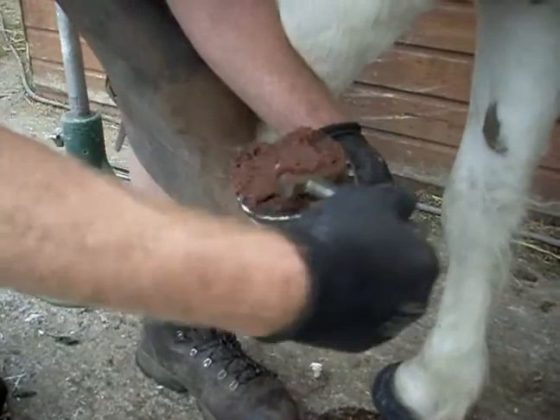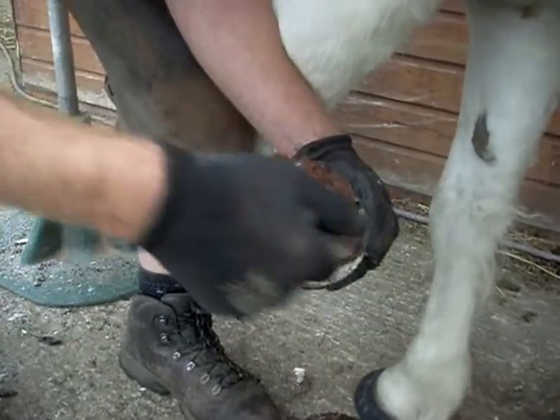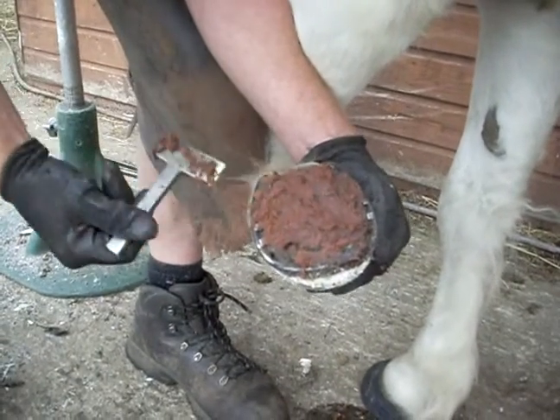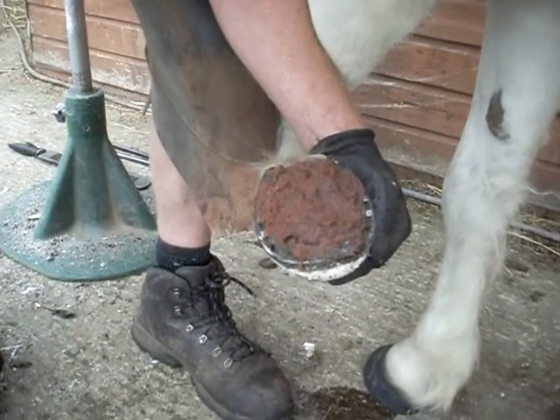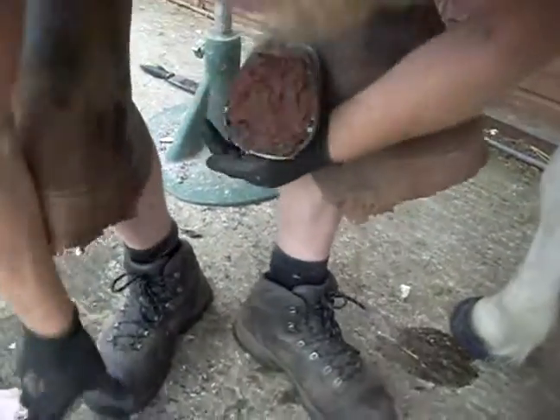As you can see, it has to be used in conjunction with some kind of pad because it's very paste-like and it wouldn't stay in there on its own. So with this hoof cast we need to support this area.